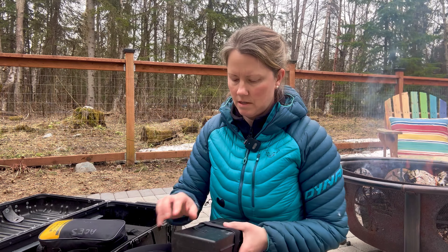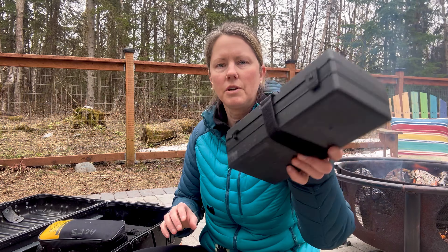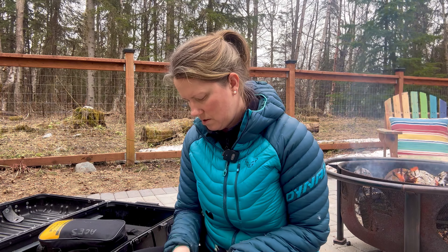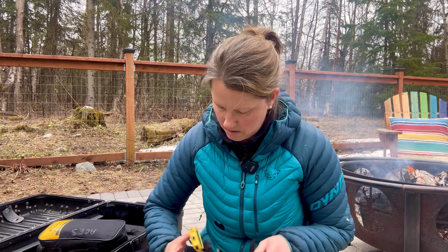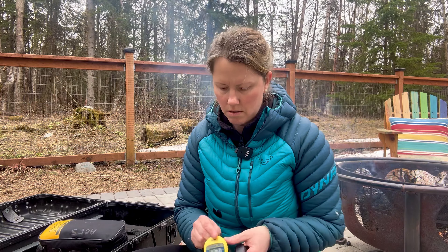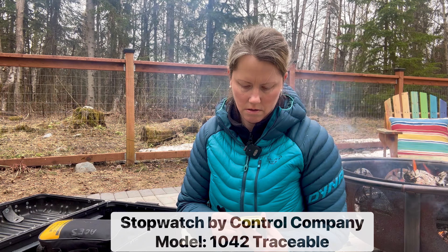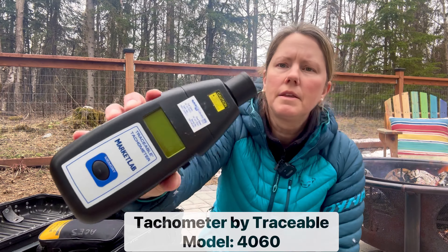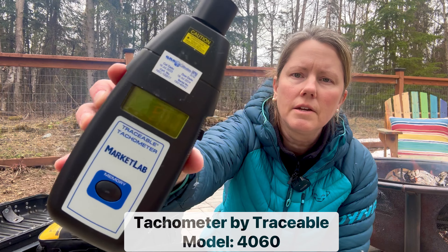I've got my box here for a tachometer and a stopwatch that I carry with me.